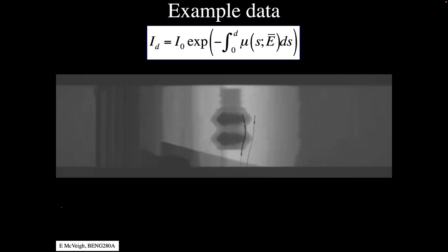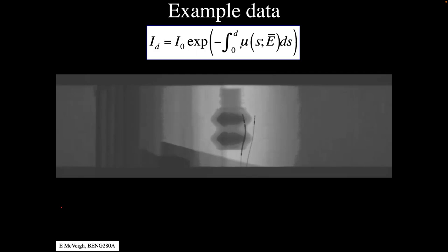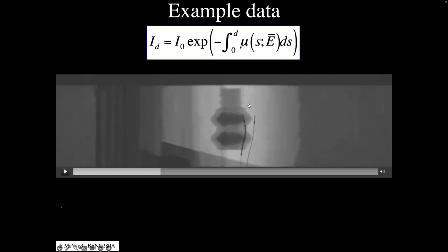Partly because a lot of times you're imaging stuff like the heart or something like that, you don't really care about irradiating the outside, the arm and stuff like that. So you focus your x-rays towards the center. You still measure some x-rays out here so that you reconstruct a picture, right? And you don't get artifacts. However, the signal to noise is dropped out there, right? So that's why there's an uneven sort of sensitivity back here.